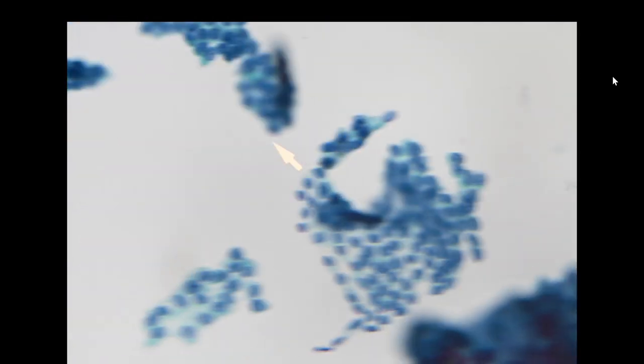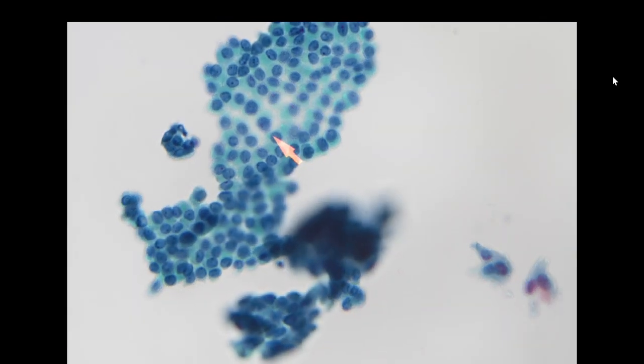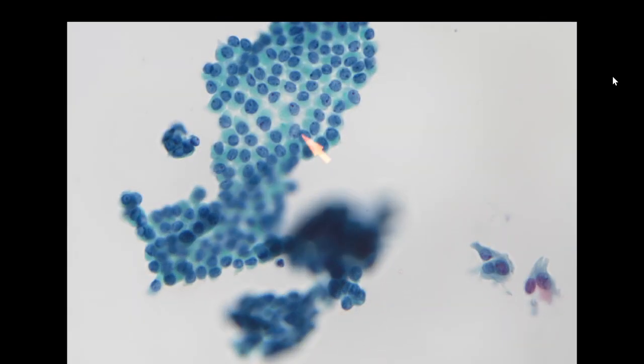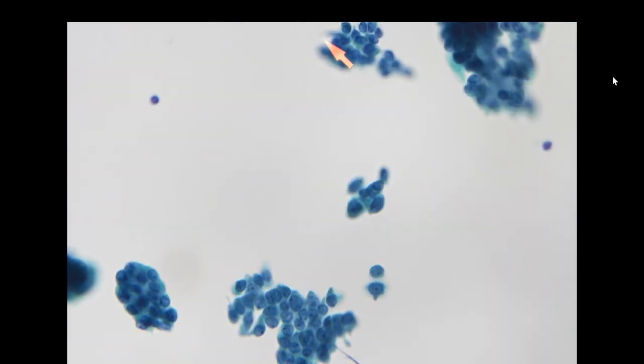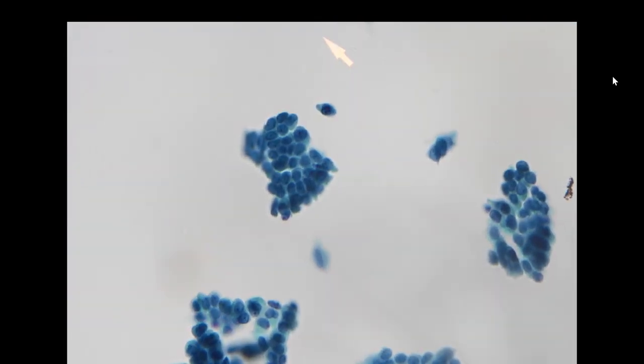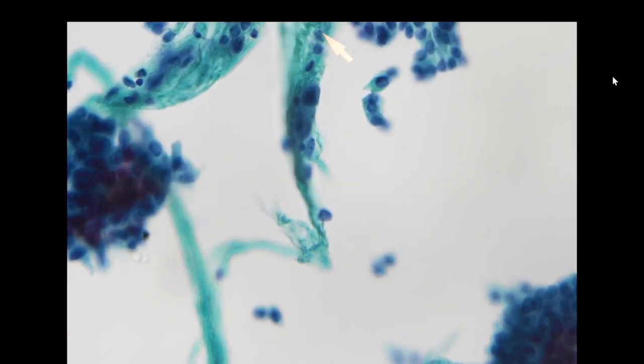Yeah, but even without the nuclear inclusion, if we have diffuse nuclear atypia, meaning almost every cell has it, suggesting PTC, we can still make a definite call that it is PTC, category 6, definite call for PTC. So I did not see an inclusion now, but this is definitely PTC, so we are going to call this PTC.